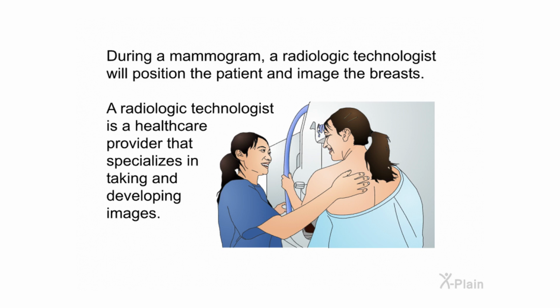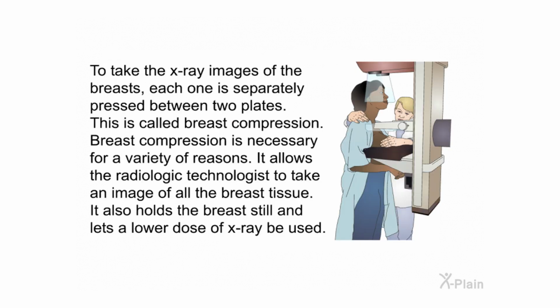During a mammogram, a radiologic technologist will position the patient and image the breasts. A radiologic technologist is a healthcare provider that specializes in taking and developing images. To take the X-ray images of the breasts, each one is separately pressed between two plates. This is called breast compression. Breast compression is necessary for a variety of reasons. It allows the radiologic technologist to take an image of all of the breast tissue. It also holds the breast still and lets a lower dose of X-ray be used.